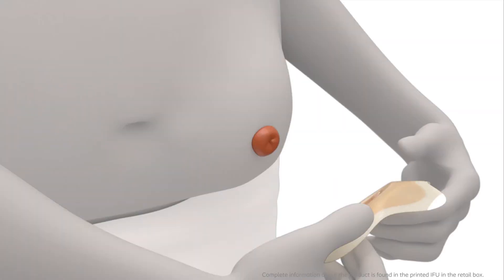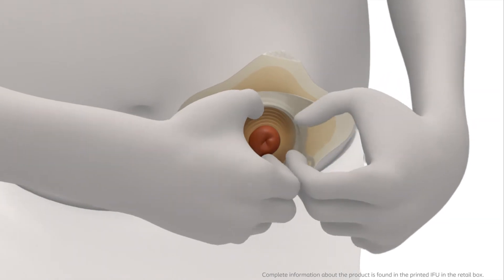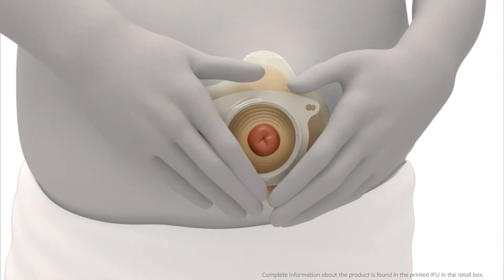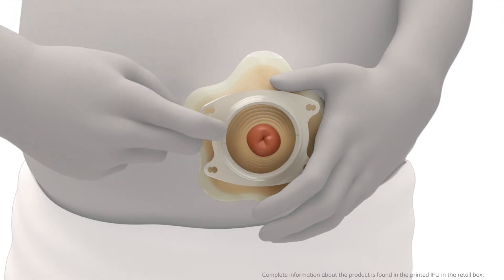Hold the adhesive with the petals folded back and align the centre part around the stoma. Press the centre part carefully onto the skin, then flip the petals down over the outward area. To ensure a tight seal to the skin, carefully apply pressure on the adhesive between the ring and your stoma.